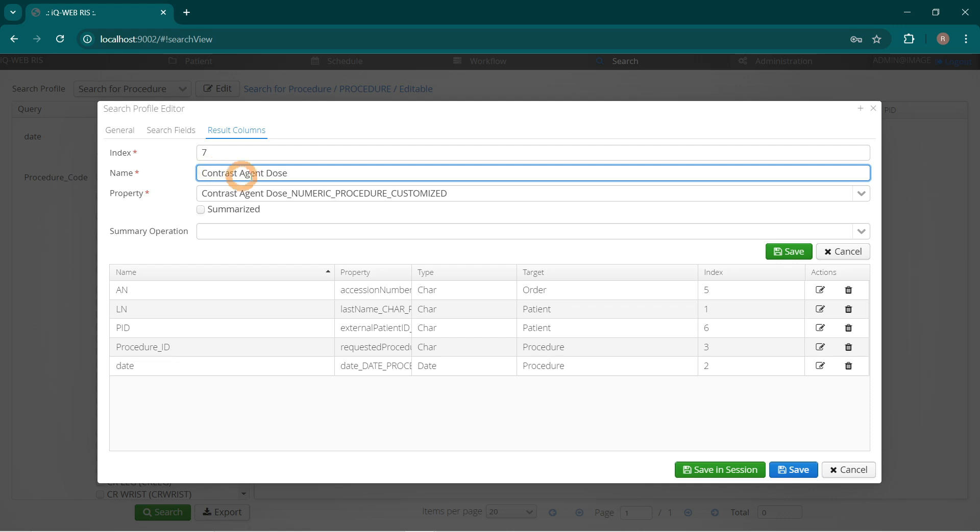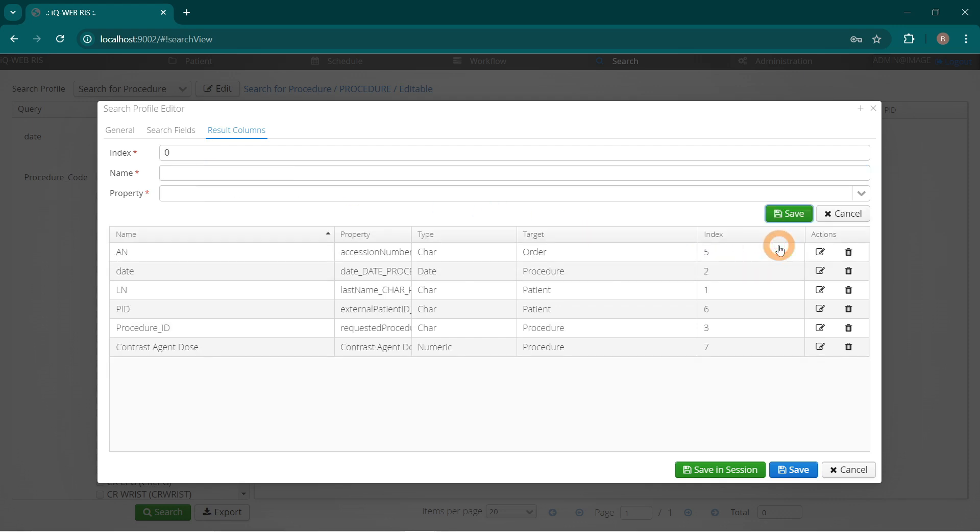Click the green Save button. A new Row 4 Contrast Agent Dose is added to the Results Fields table.